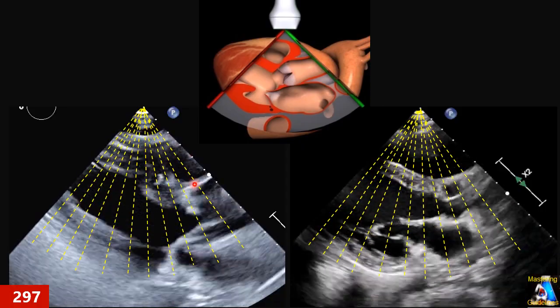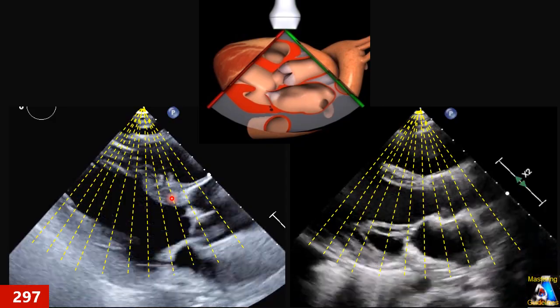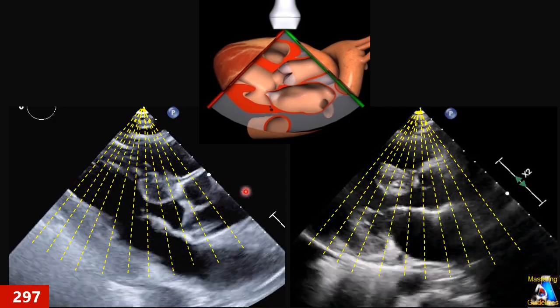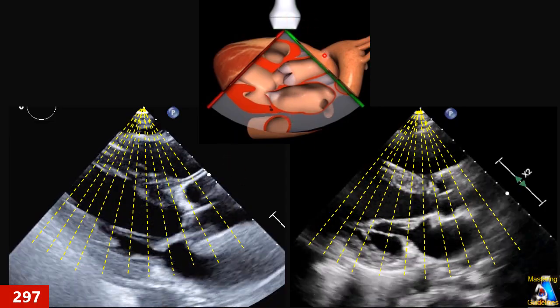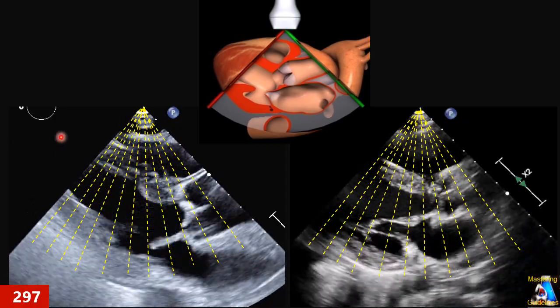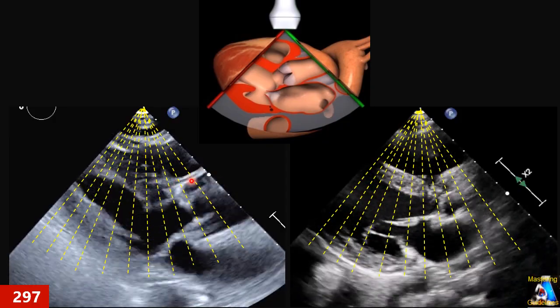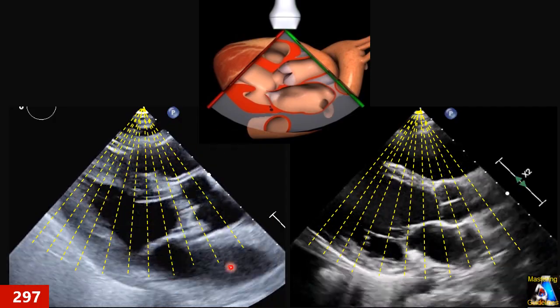Another thing is that many times you have to be flexible and do an extra study for that case. For example, if the indication for the study is intracardiac thrombus, not only do you have to try the classic view, but also get an extra image and show the whole left ventricle. Or the opposite way: if your indication for echo is a valvular disorder, you have to get an extra image and zoom on the valve.